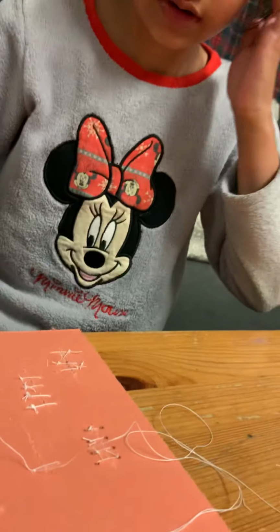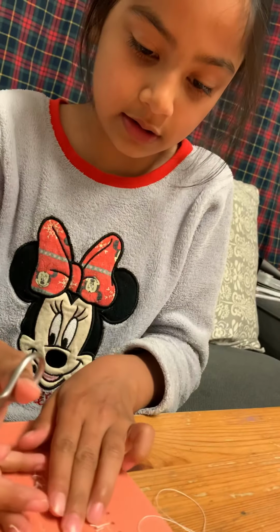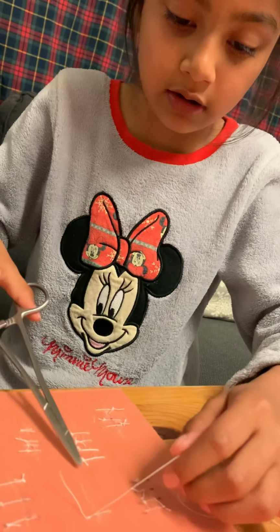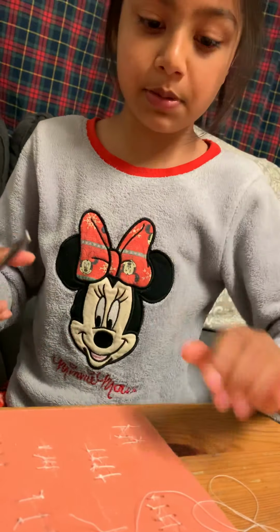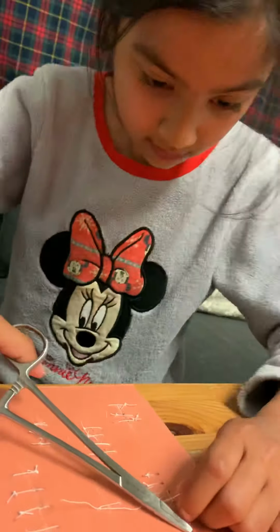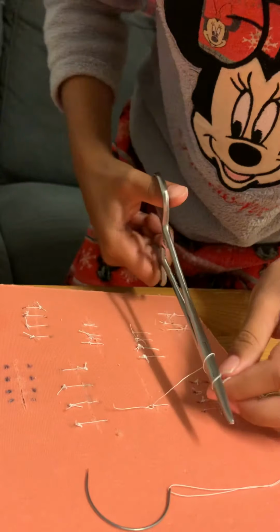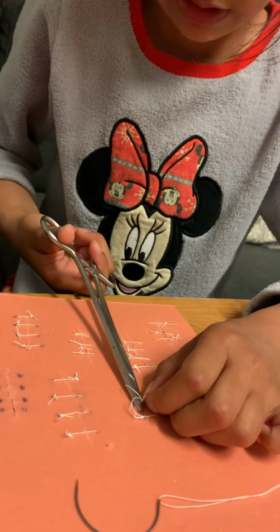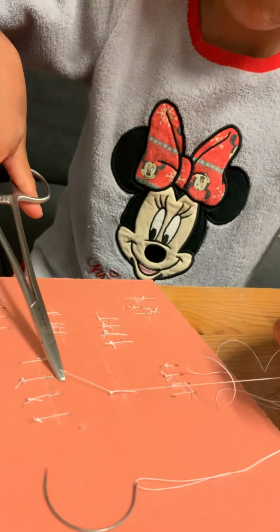You made a stitch. Now the second part is to make sure that the wound is completely secure and the skin will get completely sewed together, like a sewing machine sewing a piece of clothing. You would make second loop and first loop. So one, two loops now. And snip the edge again, but don't snip it off. It won't snip off, because you can hold as hard as you can, because this type of scissors does not cut.